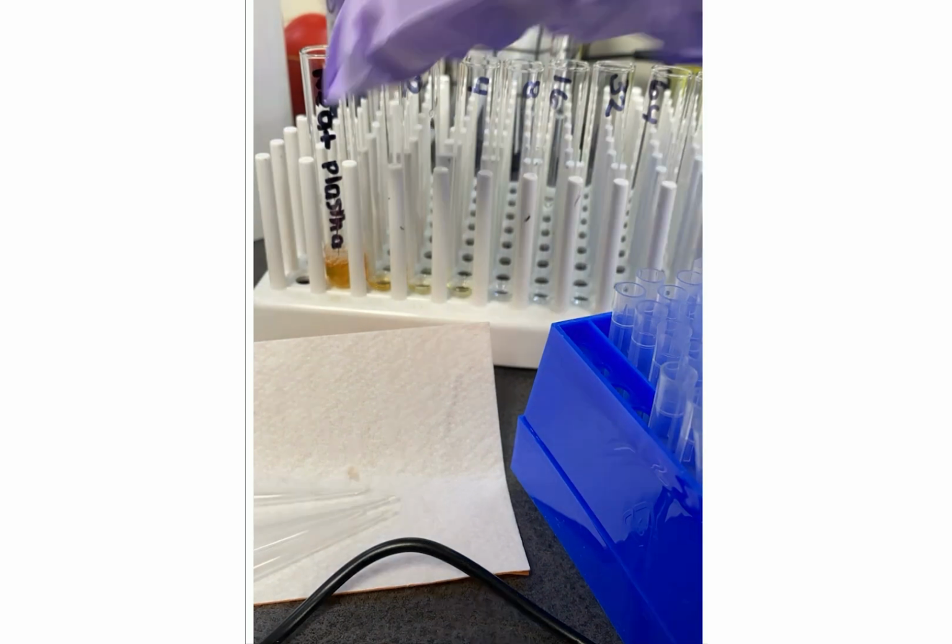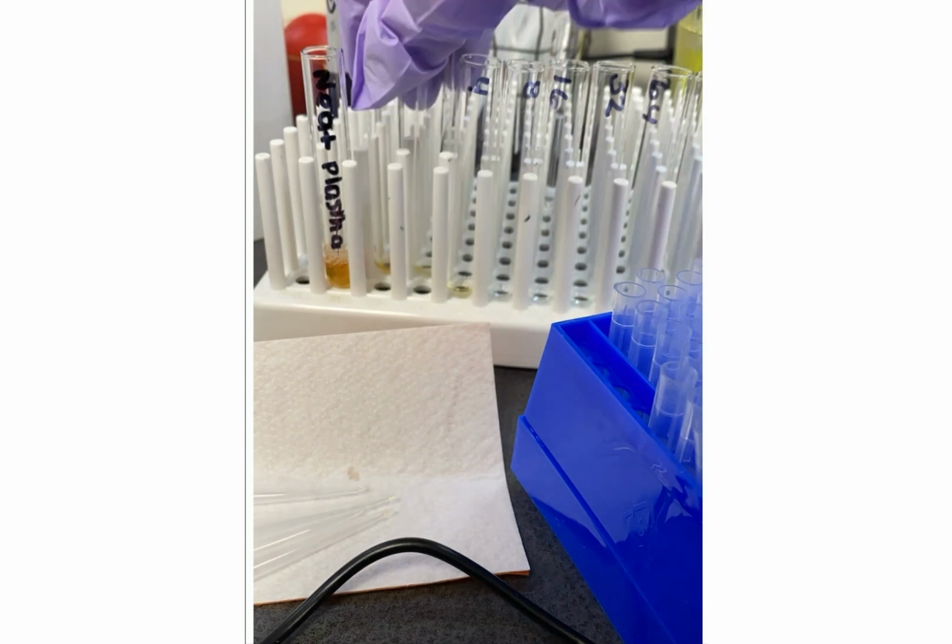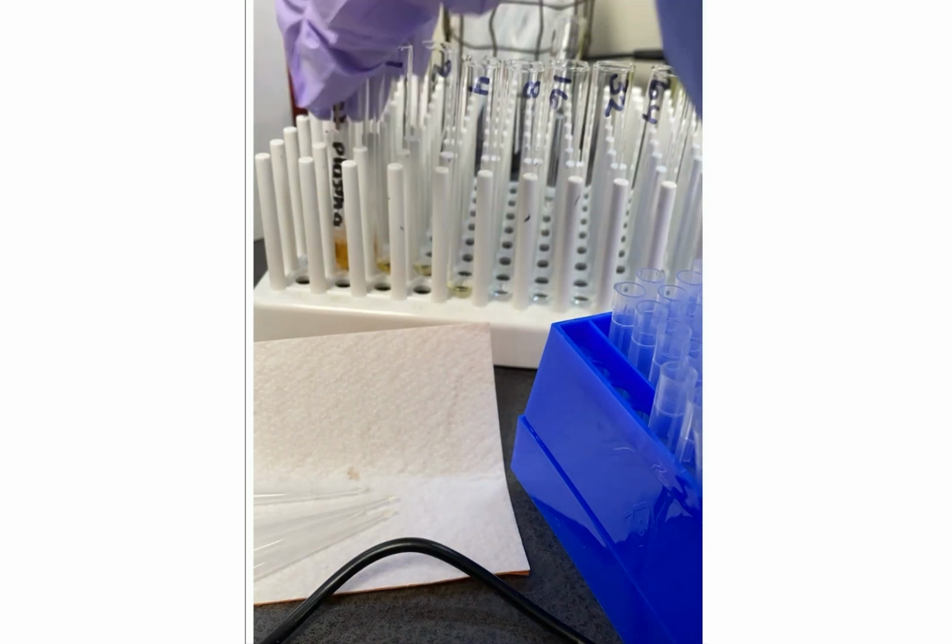As soon as I add, I discard the pipette tip. Tube number 4 now contains 100 microliters of saline and 100 microliters of dilution number 2. As soon as I add the plasma, I'll remove the pipette tip and I'll apply a new pipette tip. Once I'm done with the addition in the tube with plasma, I'll move the completed tube back in the rack to indicate plasma is added. Just a reminder for myself.